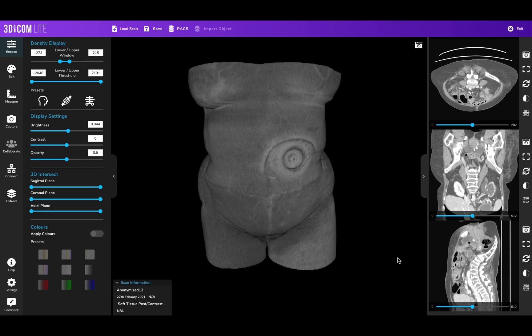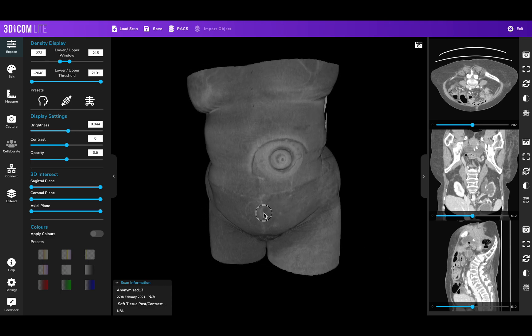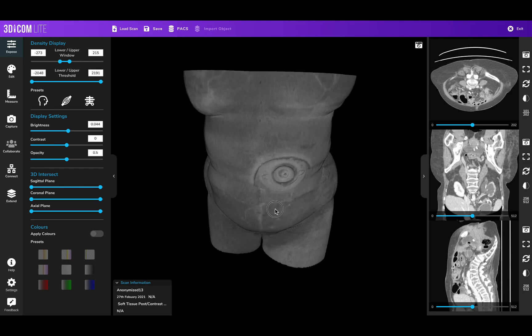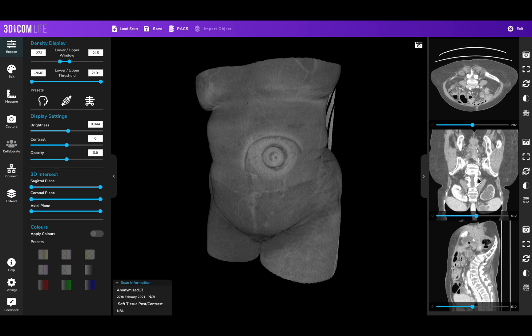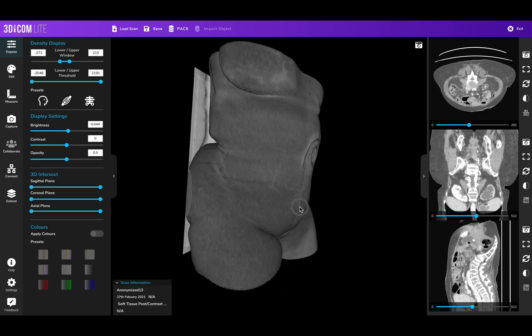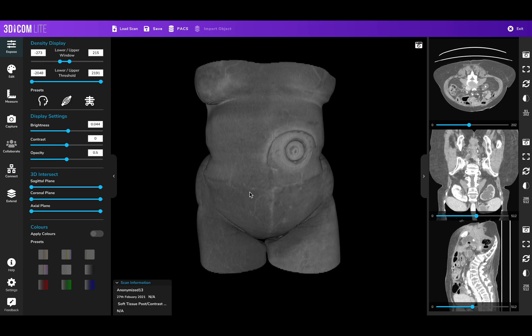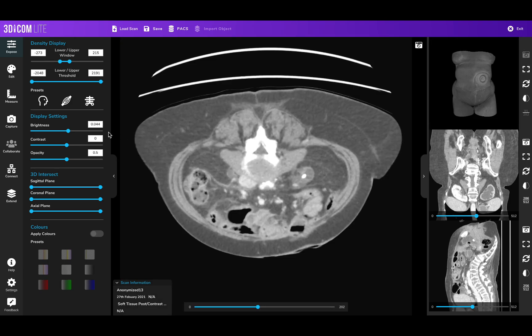In this video we'll be looking at 2D measurements in 3DICOM Lite. 3DICOM Lite being the first tier of 3DICOM provides basic 2D measurement tools. The 3D volume rendered model is compiled from a series of DICOM files, typically stored in slices. We're able to very accurately extract the DICOM slice data — measuring between different pixels and slice thickness — to accurately recreate the patient-specific anatomy. With 3DICOM Lite we only provide 2D measurement tools as it is the most basic tier.